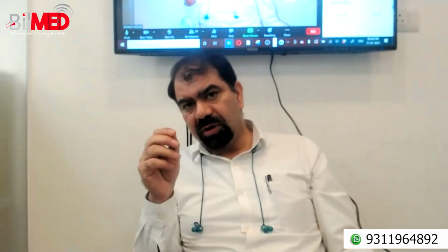Ultrasound. Both vaginal and transabdominal probe can be rotated clockwise. See, I told you the rotation. See, this is the probe. You have held this probe. This is the marker. This side is the marker. Marker should be towards the right side. Now, see, this is the marker. Marker should be towards the right side of the patient.